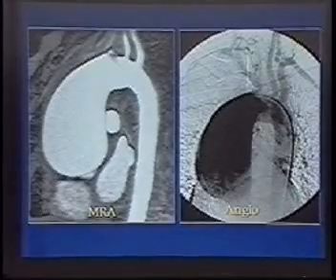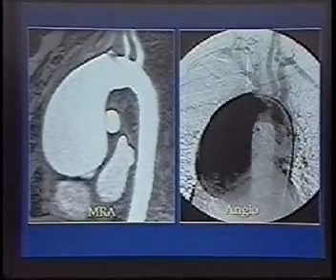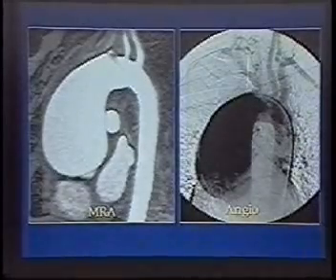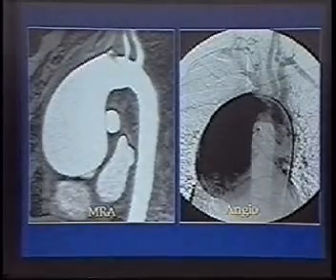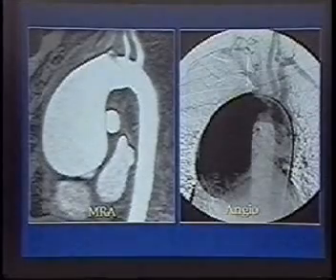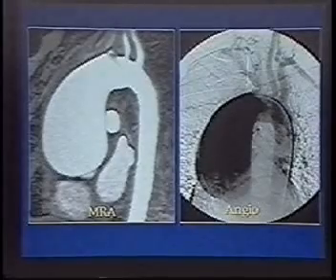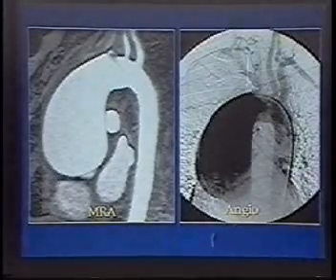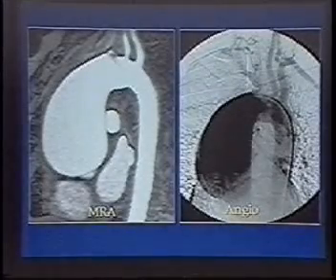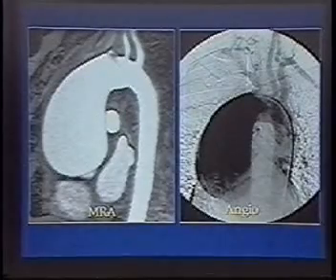So nowadays, thoracic angiograms, thoracic aortography is usually reserved for trauma cases. You may do a CT, and you can do the angio in conjunction with the CT scan in trauma if necessary, if the CT doesn't answer all the questions. But you shouldn't do it for dissection if you have access to CT, MR, or transesophageal echocardiography because of the risks and lack of necessity.